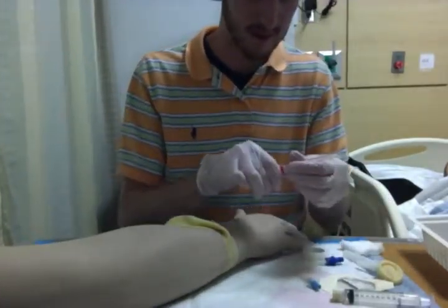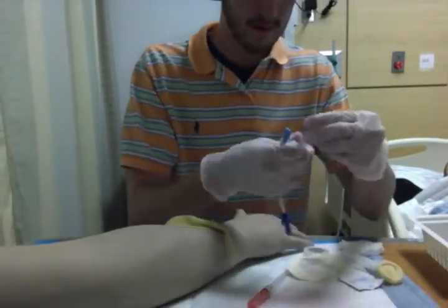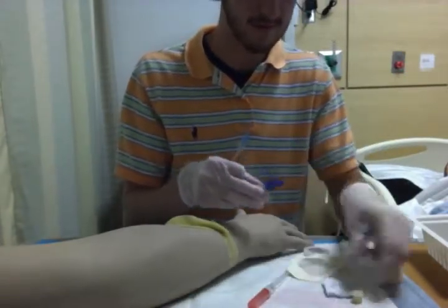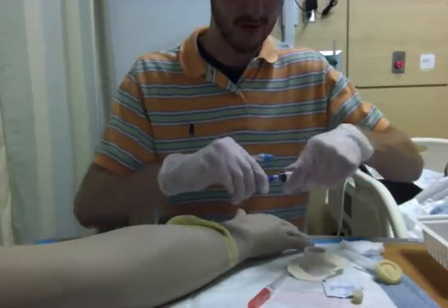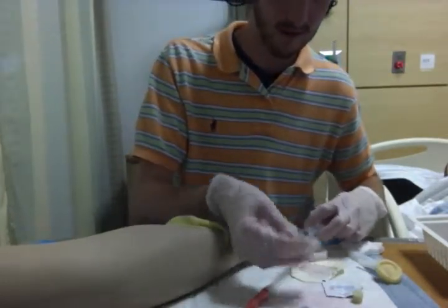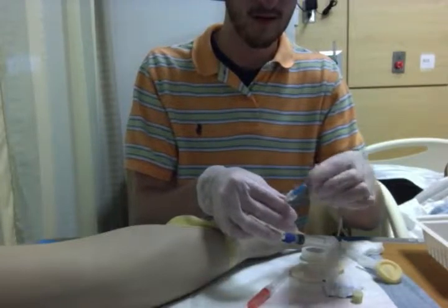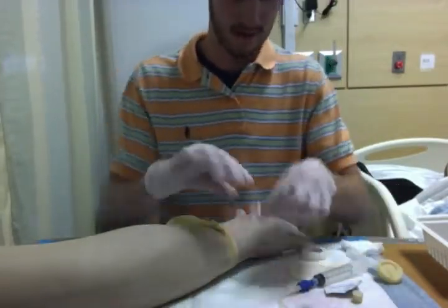Now that I've felt the vein, I'm going to get this all ready. First I would wipe this off and scrub the hub and put it on to the syringe. Flush it out — the liquid that's inside — so that there's no oxygen within the tube. Making sure that I didn't get this contaminated, I'd put it back on. And then I would get this ready.